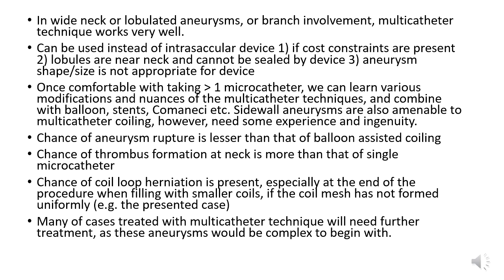But if you're taking three, then it's preferable to take thicker guide sheaths like Blast or even Cerebase and similar kind of things, which have a flexible end and they can go up to the petrous region. Keep it high, and you can use three devices also, or at least even if you're using only two microcatheters, it allows you to have a good flush so that you don't have thrombus formation and you don't have poor injection of the DSA runs and all.